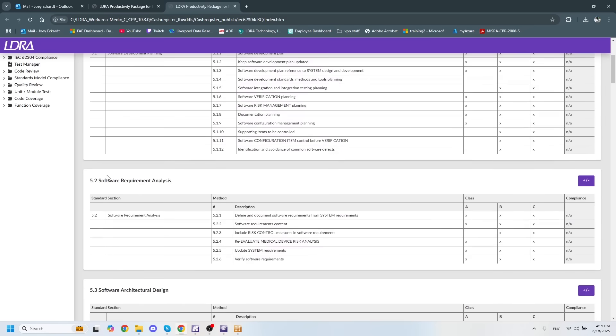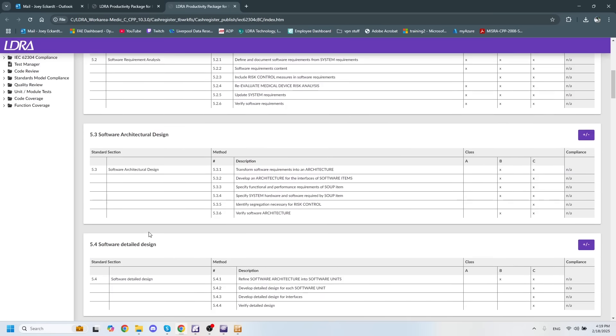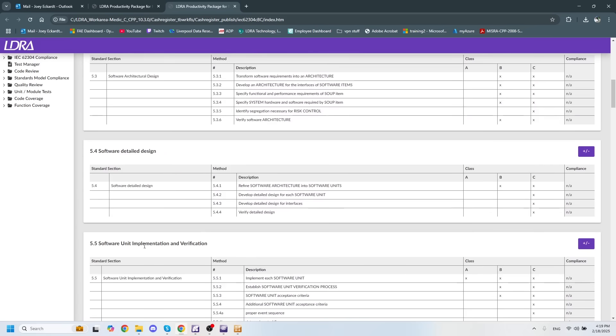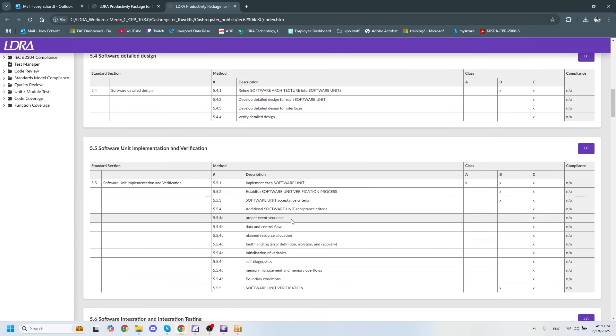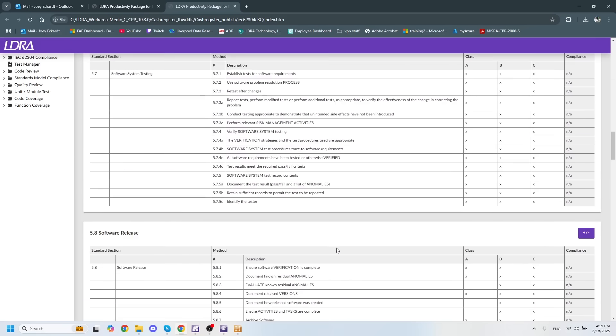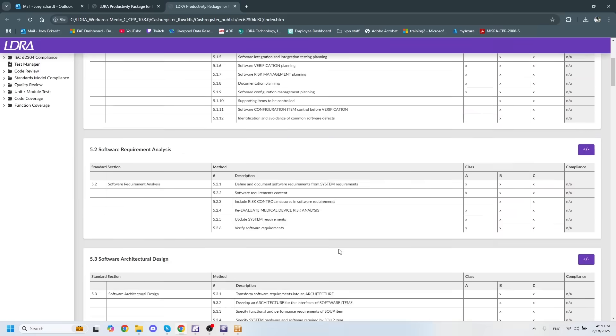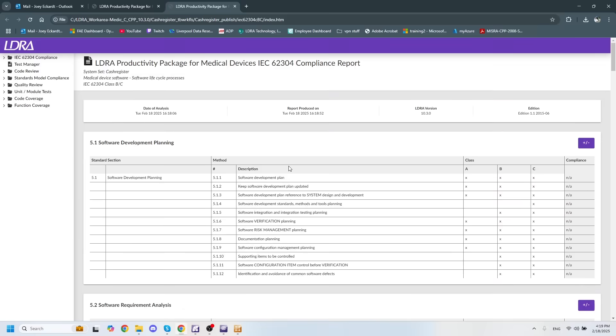And this goes into software requirement analysis, architectural design, detailed design, and various different other categories that will help us gain compliance with this standard.